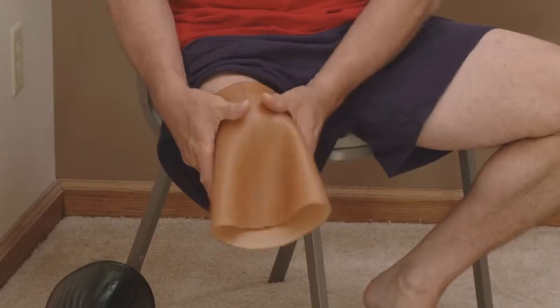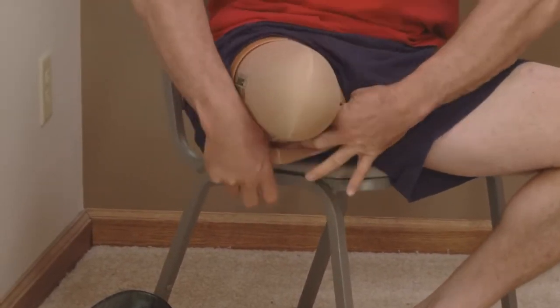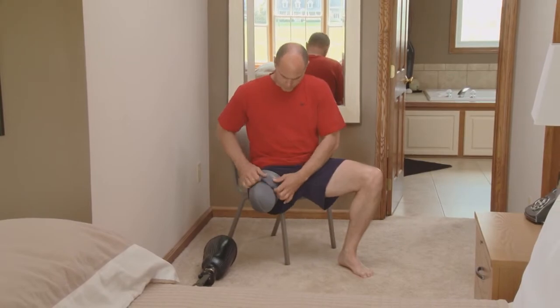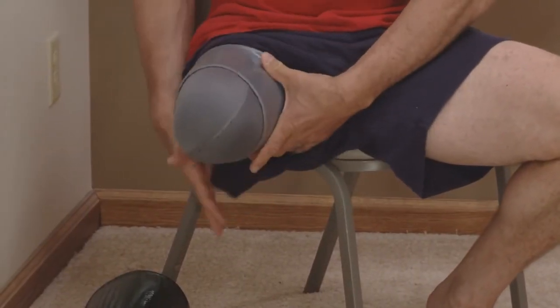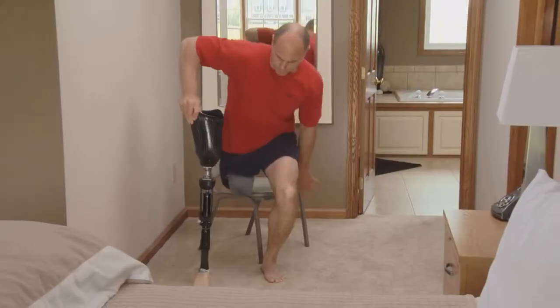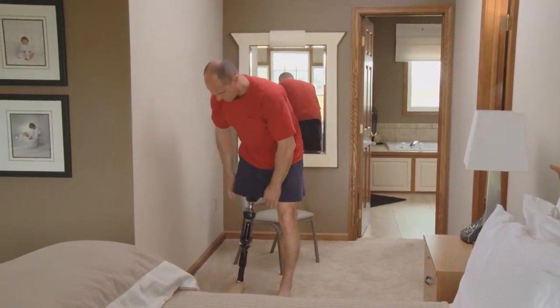For AK amputees, the orientation of the liner is slightly different. When donning an Alpha Classic AK liner or an AK Design liner, the logo should be to the side. For an Alpha Hybrid AK liner, it doesn't matter which way the logo is facing, but the life of the liner may be extended if you vary the orientation of the liner each day. Then, carefully roll the liner up onto your limb. Make sure that there are no wrinkles or air pockets between your limb and the liner, and then don your prosthesis.